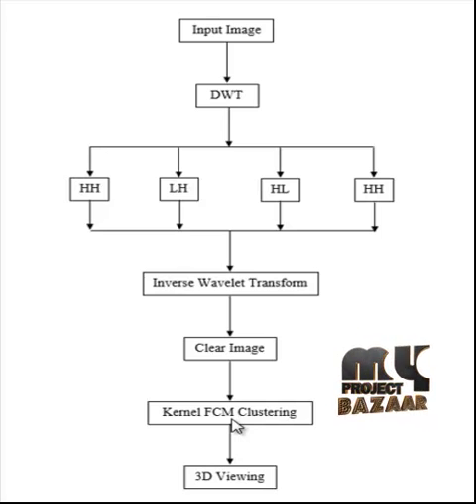So this process is helpful in the clustering of the images, and also we can know about the different intensity regions in the images. For each cluster, the cluster centers are obtained. Based on that, the thresholding operation is employed in order to extract the object portions alone in the images, eliminating the background.